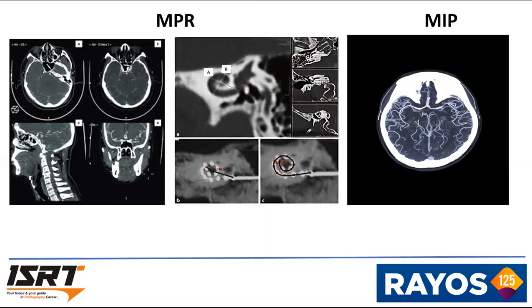So here we have the generosity of creating the image in multiple planes because of software developments. The accurate axial image can be reformatted into any plane, three planes or any plane, depending upon the requirement of a radiologist or clinician.